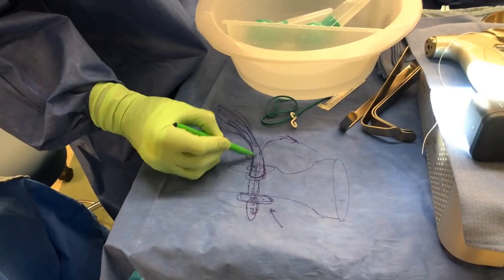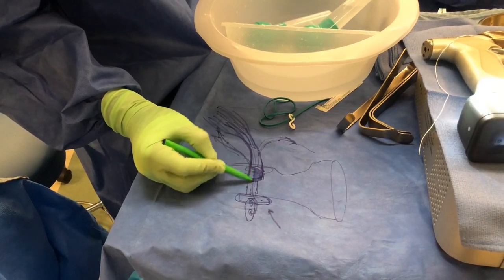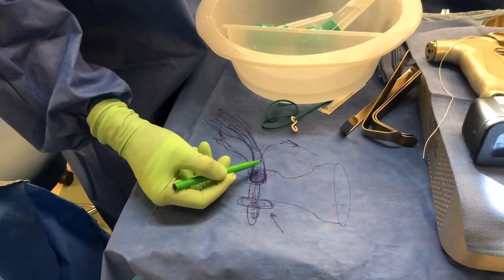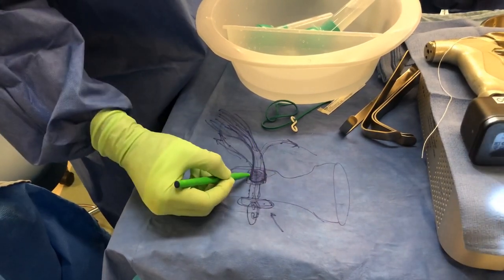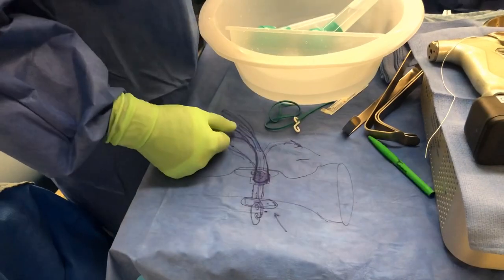Now I'm going to tie this down, and in the end what will happen is this tendon will actually spot-weld itself onto the bone — that's called natural fixation. This is the distal biceps repair with an endobutton, single incision. Dr. Moore here, thank you so much.